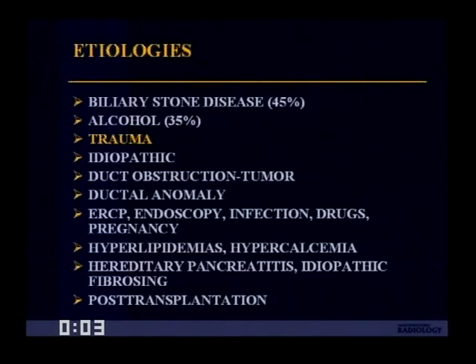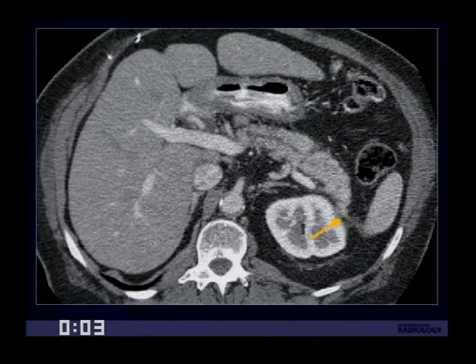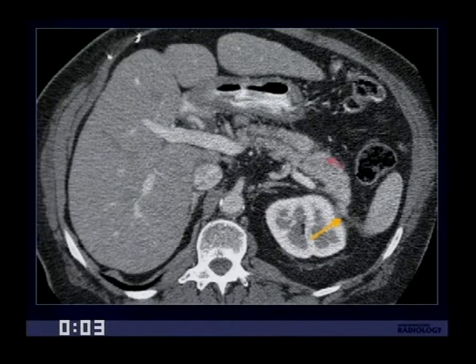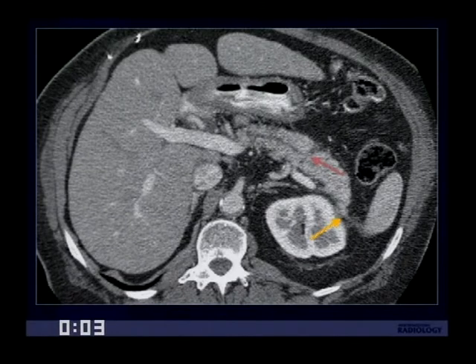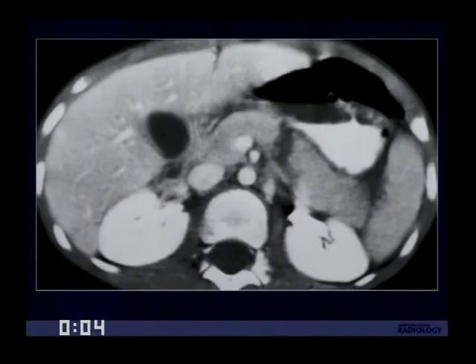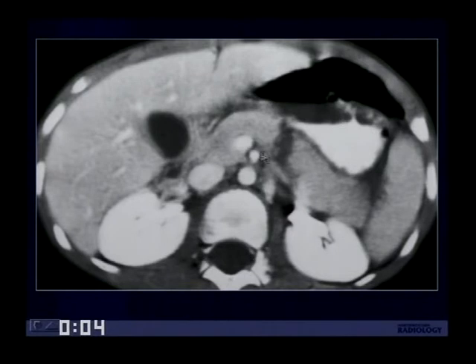Other etiologies of pancreatitis include trauma. CT plays a critical role in the diagnosis of pancreatic injury. You need to look for the presence of a laceration — this is the typical location of a pancreatic laceration in trauma, and the prognosis can be significantly worse in the setting of pancreatic injury. This is another patient — a 7-year-old child injured on a bicycle — who nicely demonstrates a pancreatic laceration extending through the body of the pancreas.